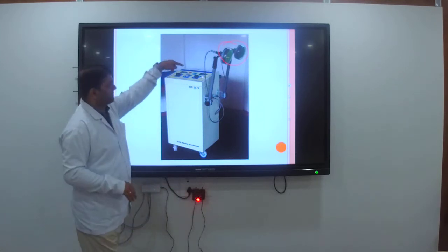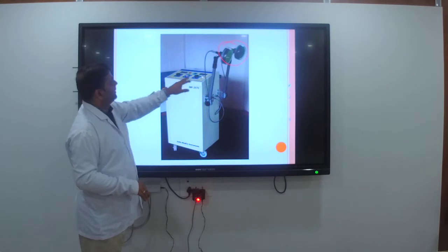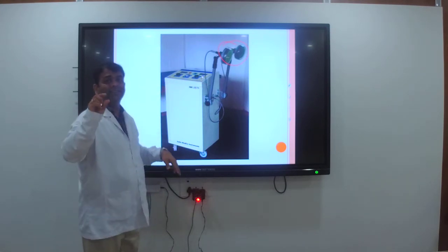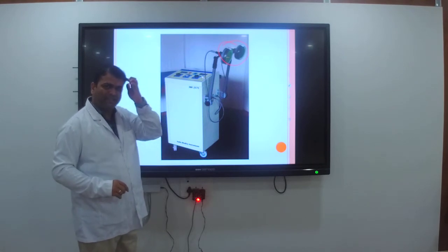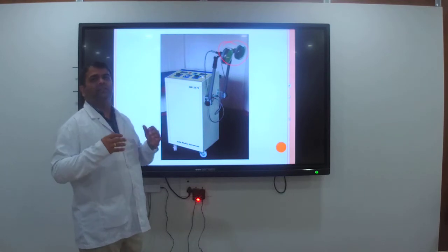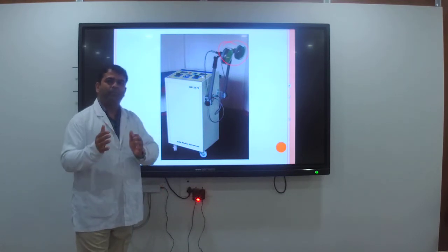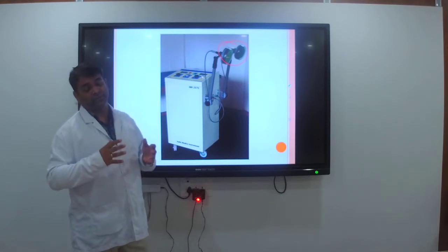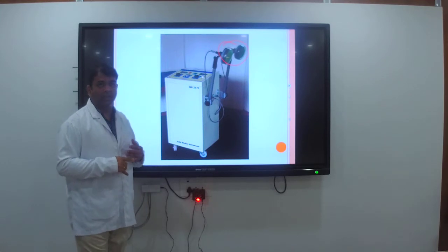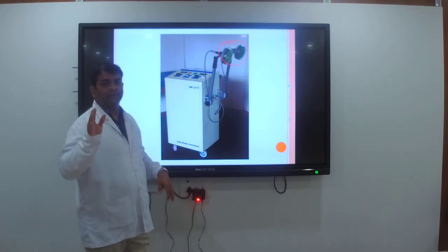Now, as I said, that's the main switch. You have to turn it on. After that, this small switch you can see over here is a timer. Now, why the timer? It is very important. SWD is a very deep heating modality, it should not be given over a certain period of time, which if it's given, will cause serious side effects and burns to the patient. So timing should be adjusted as per the protocol.